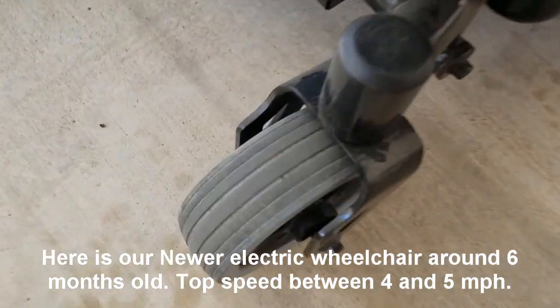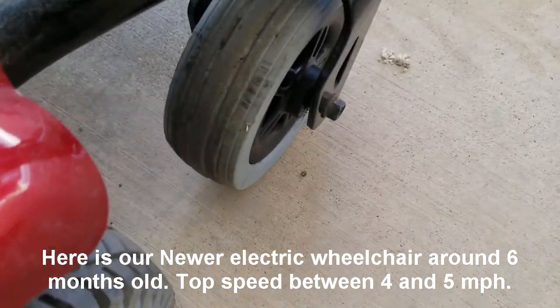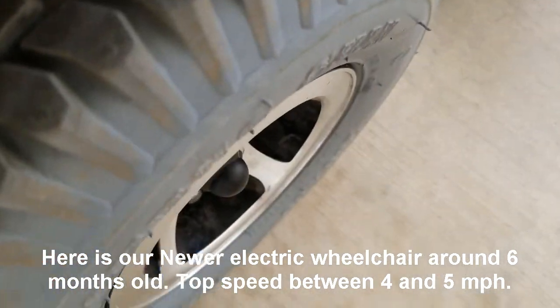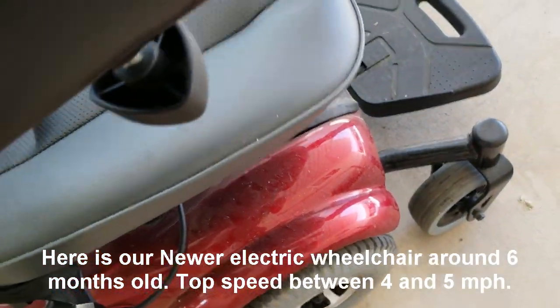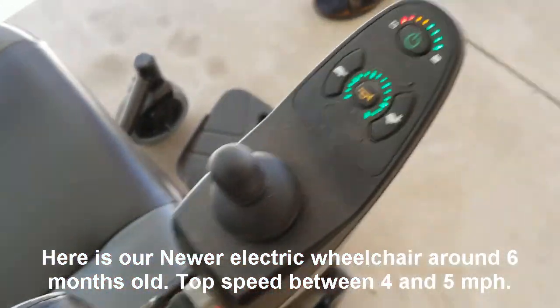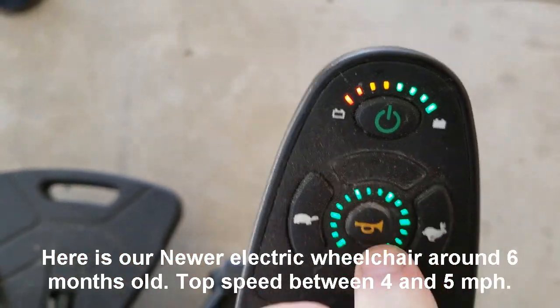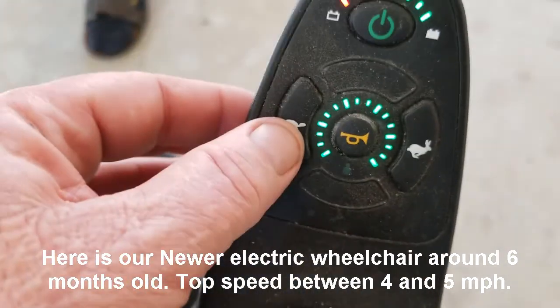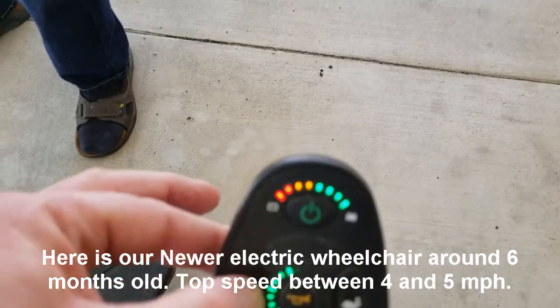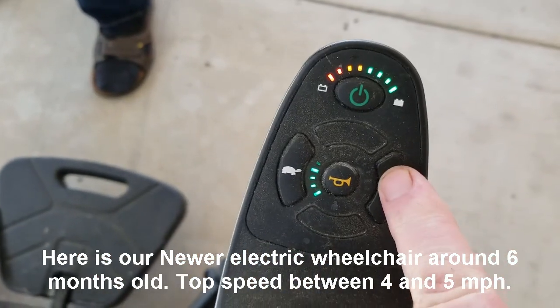And there are the wheels — they're in excellent shape, almost brand new. All it has is a little bit of dust, but the chair works just fine. Here is the horn — there's the horn. And if you want to slow it down, you turn that down; this speeds it up.